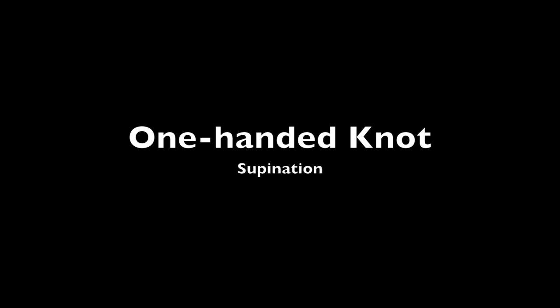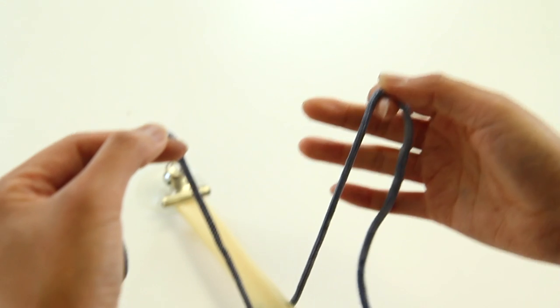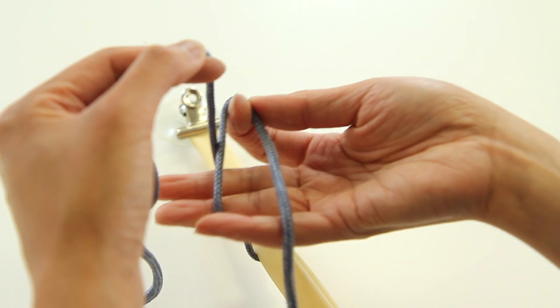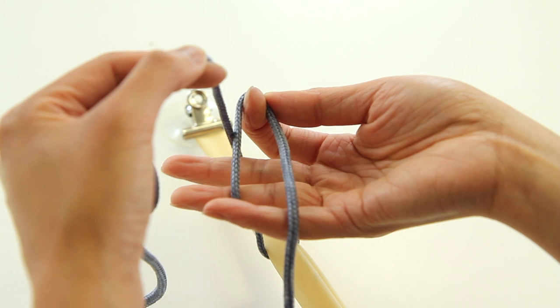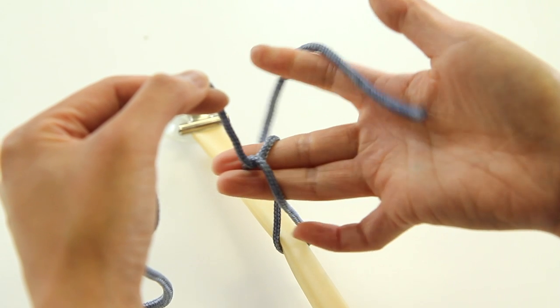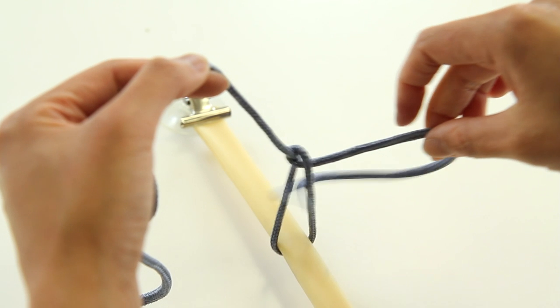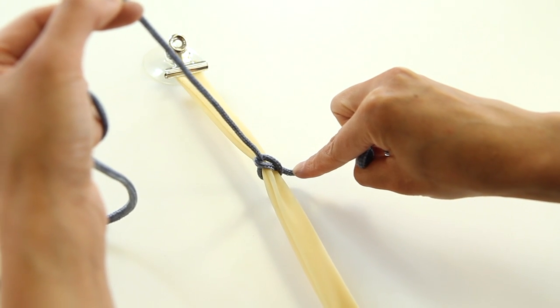This section teaches a different technique for throwing knots — the one-handed technique — where the hand holding the tail does all of the work. Remember this technique refers to how knots are thrown, not how they are laid down, so you can create either half hitch or square knots with it. Holding the post straight and locked, grasp the tail firmly between the thumb and forefinger of your dominant hand. Supinate so that the suture is hooked over the fourth digit, then bring your hands towards the post so that the two suture ends cross between the second and third digits, forming a four. Use the third digit to hook underneath the tail so it can be grasped by pinching between the third and fourth digits. Pulling on the tail flips it through the loop to form the knot, and the tail can be re-grasped between the thumb and third finger in one fluid motion. Use a regular gathering maneuver to position your hand to lay down the knot.